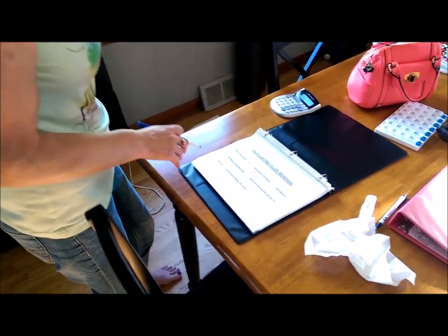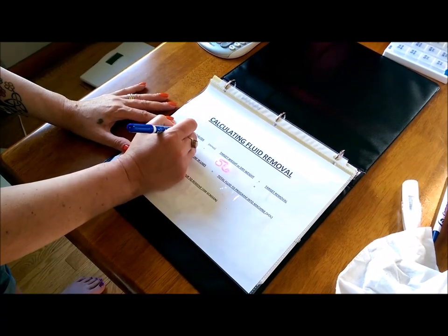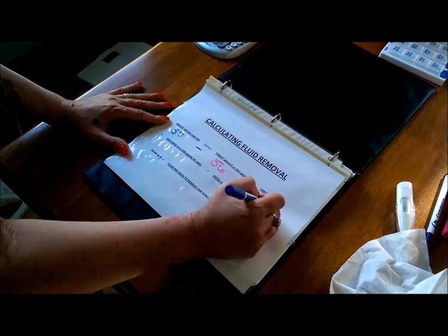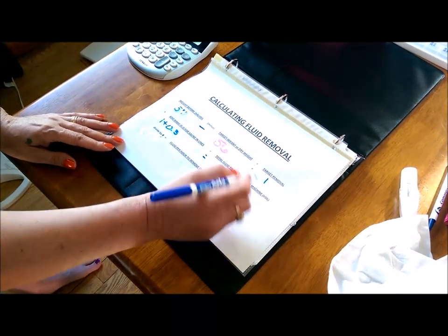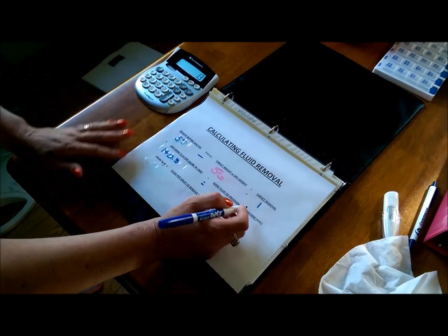Now we're ready to program in our numbers. It's time to calculate the fluid removal. Fluid is, of course, urine that you're not urinating out when you're in end-stage renal failure, and also other toxins that build up in your body that your kidneys naturally filter out. My target weight — my dry weight — is 56 kilos. My weight today was 57. So we subtract the dry weight from the weight today: target removal is one kilo. Then we always add in 0.3 for saline. I always use a calculator because this is something you don't want to ever get the decimal point in the wrong place.